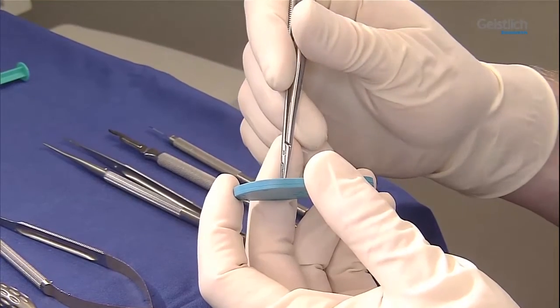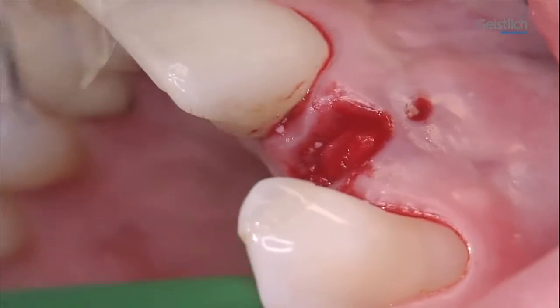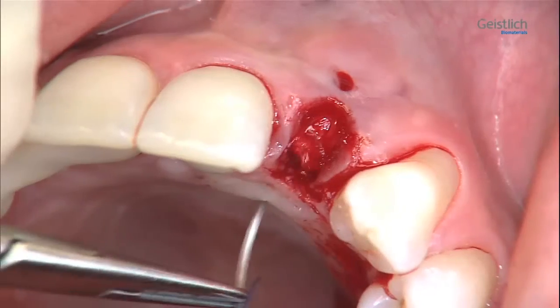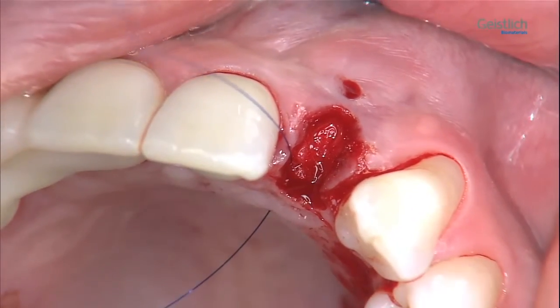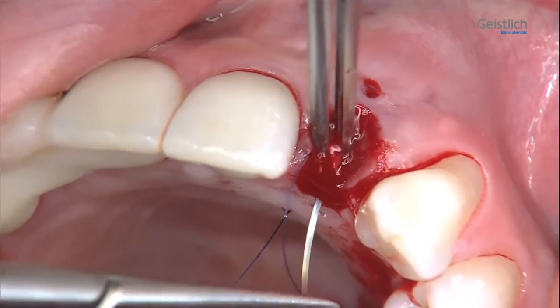The Geistlich BioGuide is fastened with a vertical mattress suture on the palatal gingiva, allowing secondary intention healing. Here, we use a microsurgical Seroline 6-0 suture.